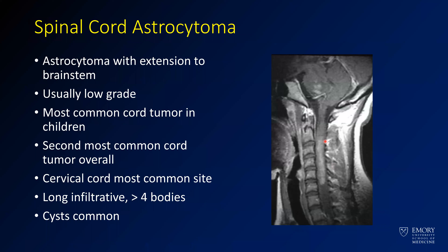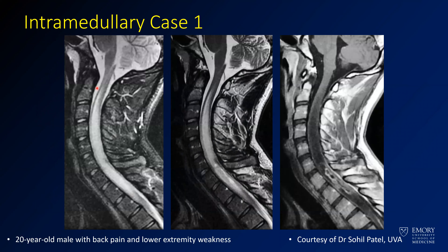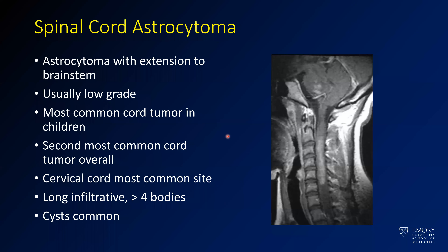This is a different astrocytoma with some extension up into the brainstem. Most commonly, astrocytomas in the spine are low grade. They're more common in children and represent the second most common cord tumor. The cervical cord is the most common location and they tend to be infiltrative, with long segments of T2 abnormality. Unlike brain tumors, low-grade astrocytomas in the cord tend to enhance, so you don't necessarily know the grade from its degree of enhancement.